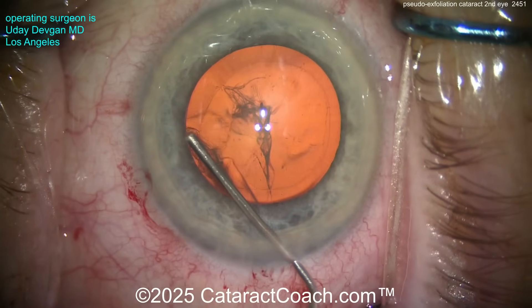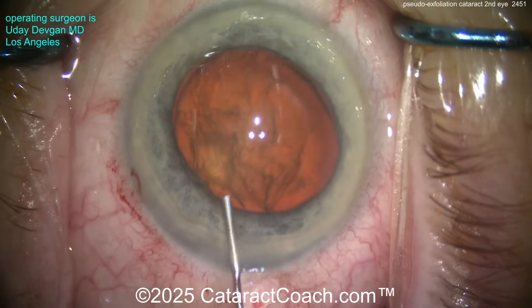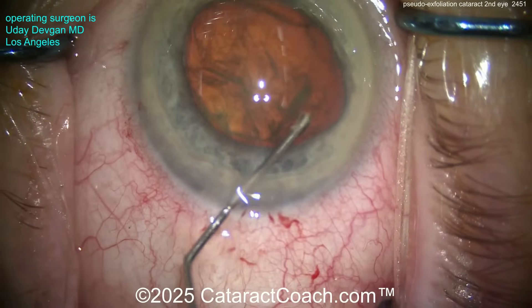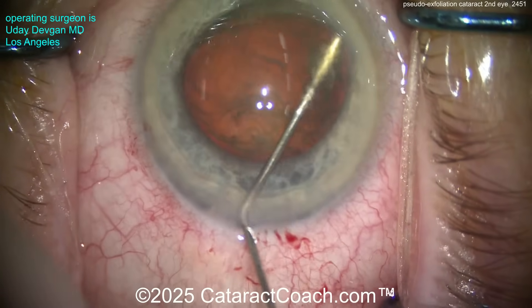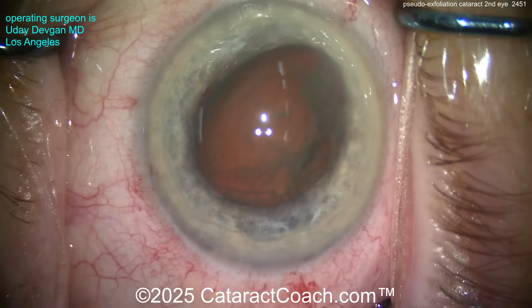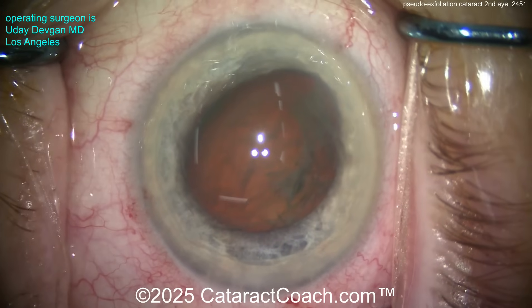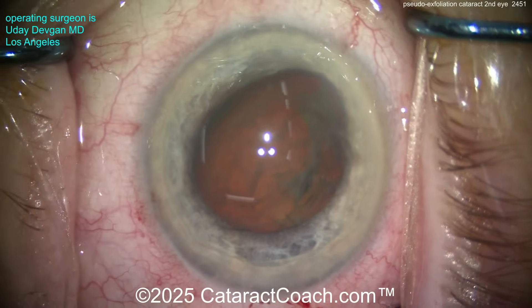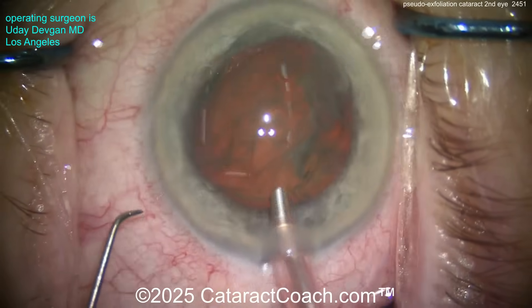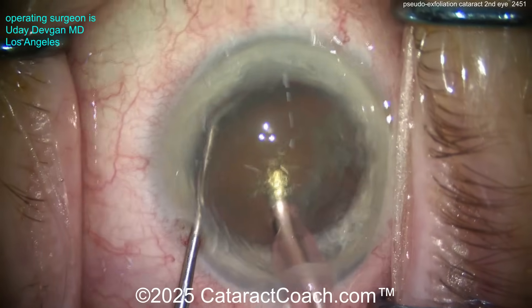The nucleus removal will be straightforward. This video is a complete cataract case — we're going to show you the whole case start to finish. If you go to the Cataract Coach website and click on the complete cataract cases, those are all cases where I'm operating — no guest surgeons. Complete cataract cases will only be me operating because, like I told you before, I'm a special snowflake. And those are unedited cases like this, start to finish, no edits. On those cases you can learn a lot.